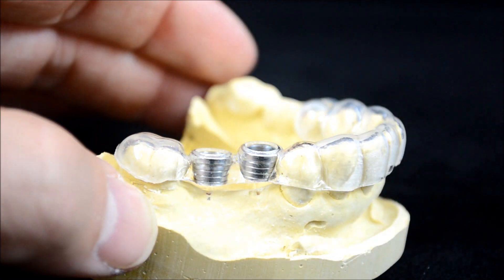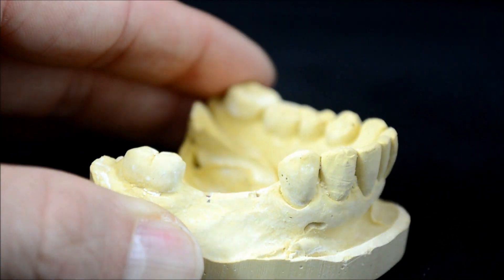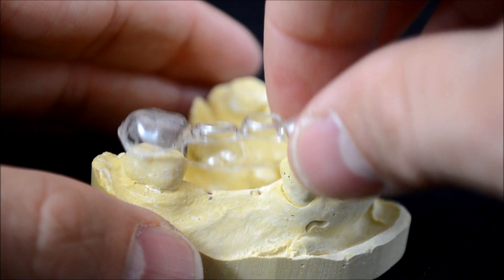Thin layer guides are based upon CT scans and restorative-driven virtual treatment plans. We are happy to train you on implant planning or to plan the cases with you.